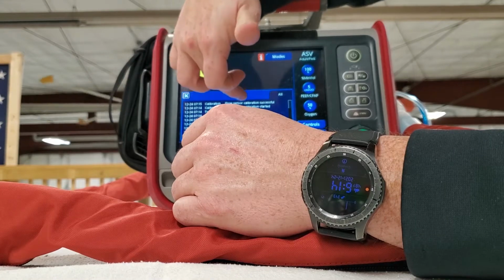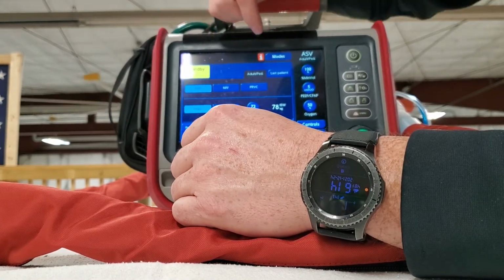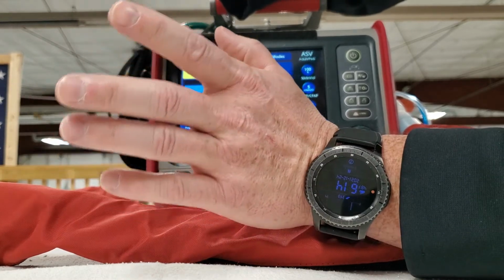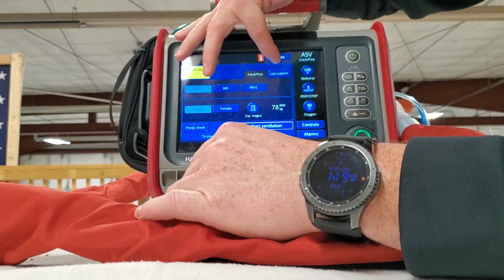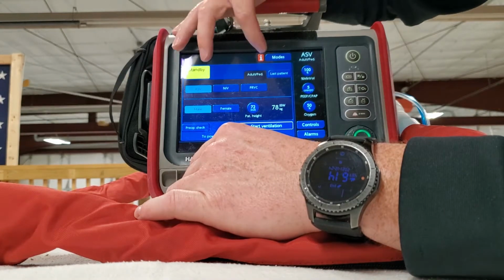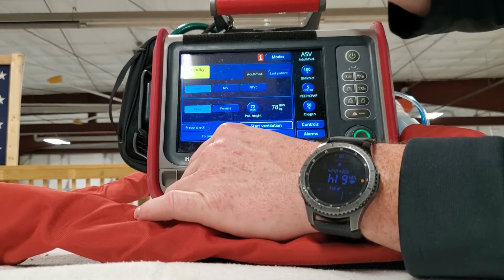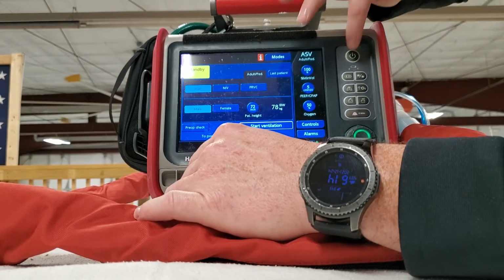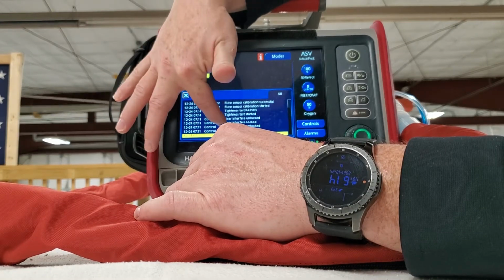Now you can get into this screen. You've gotten a patient off the ventilator, you're going about it, you shut the ventilator off. Yeah, crap, I didn't figure out the events. You can turn this ventilator off, and then you decide you want to get it, so you go turn it back on. You can go to last patient, and you can still get into the events screen.